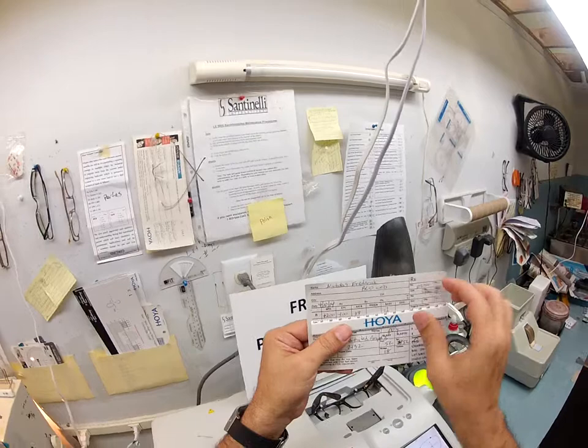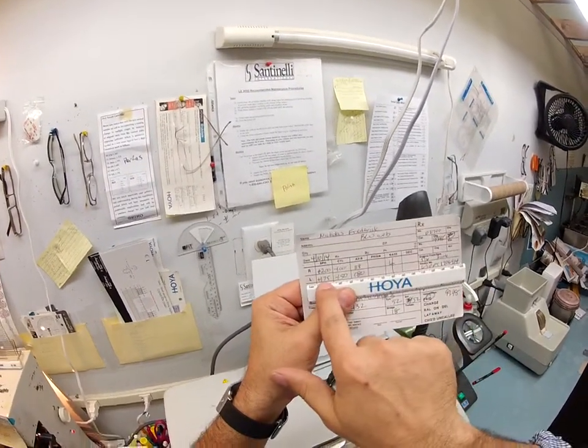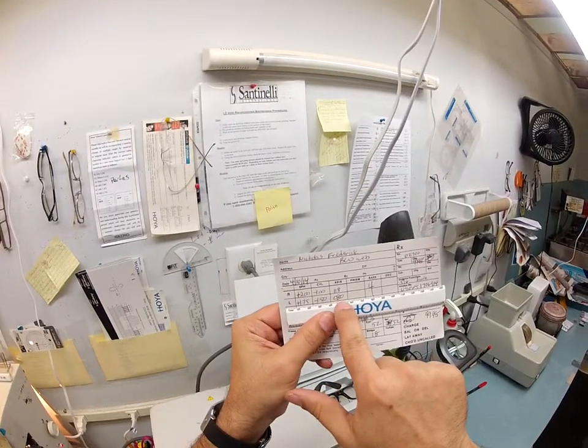Your right eye reads plus 2, minus 1 at 118. Your left eye reads plus 175, minus 150 at 80.